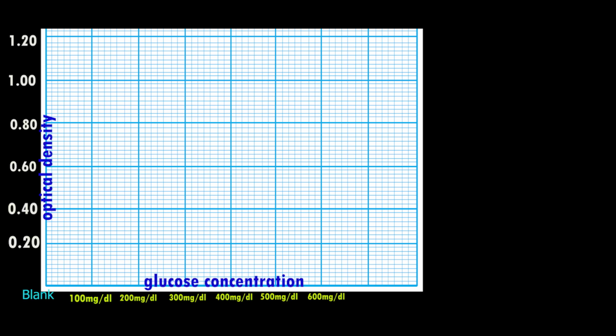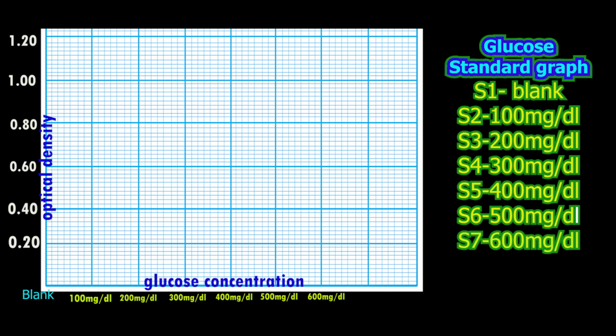This working standard is used as a quality control material for each day, each shift or each batch of samples. If the working standard is within the 2 SD range, the patient results are reported. The stock standard can be refrigerated with preservative for a long time.